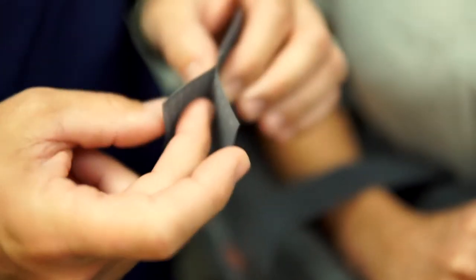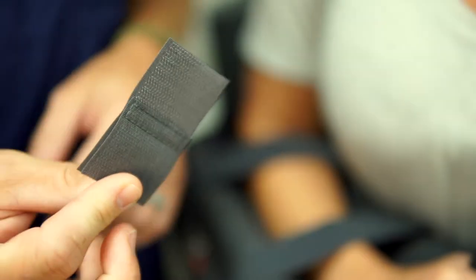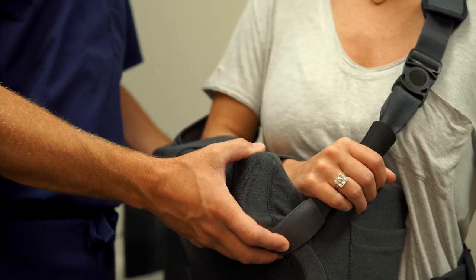Each of these straps are attached by a Y connector, and then the strap goes in there and can connect easily to the pillow, so by doing that you can make all of these fit as ideally as you want.